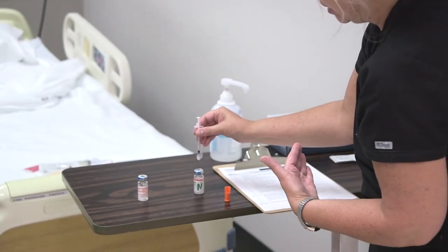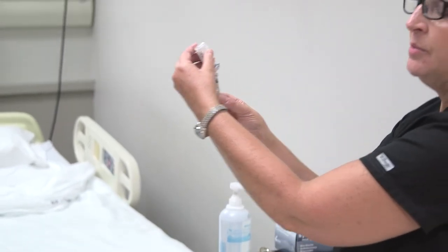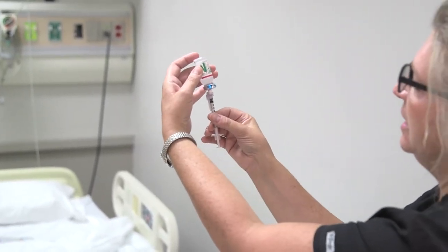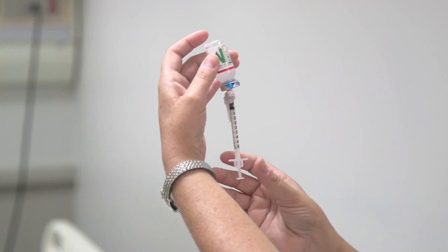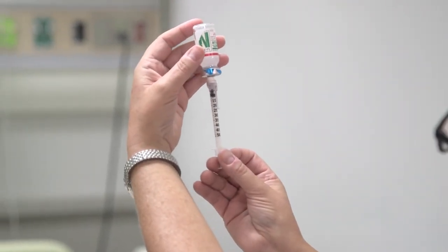Now I'm ready to draw up the NPH. This is the tricky part because you cannot put any of the regular back into the NPH vial. You have to get it right — you can't push the syringe up and down. You just pull out what you need and be done. If you draw out too much, discard it and start all over again.